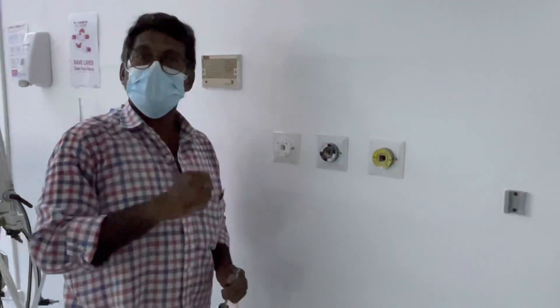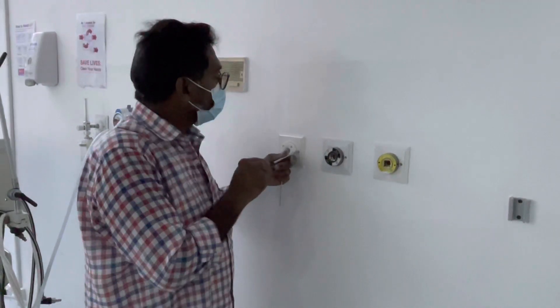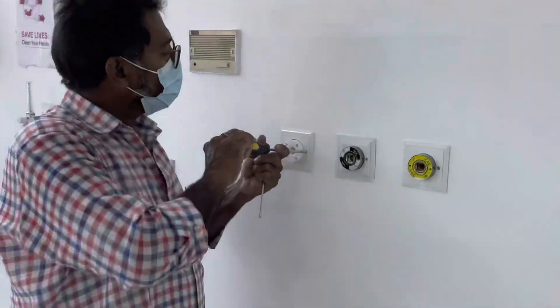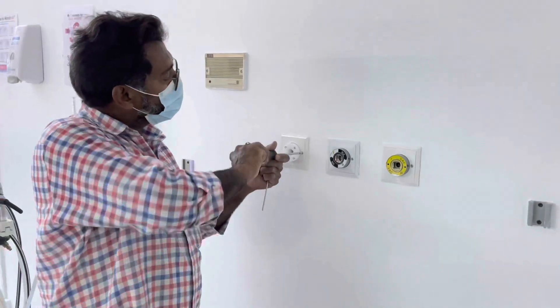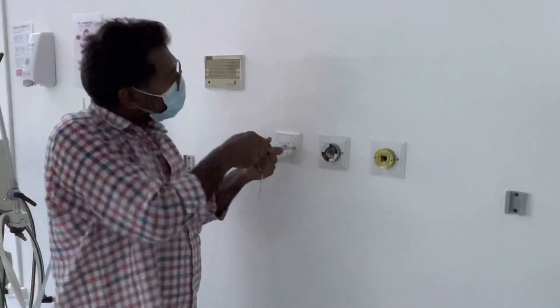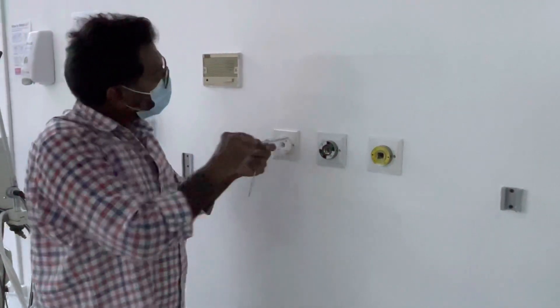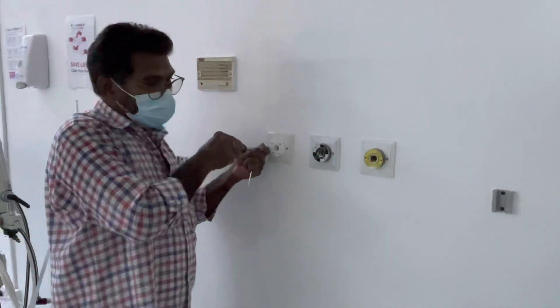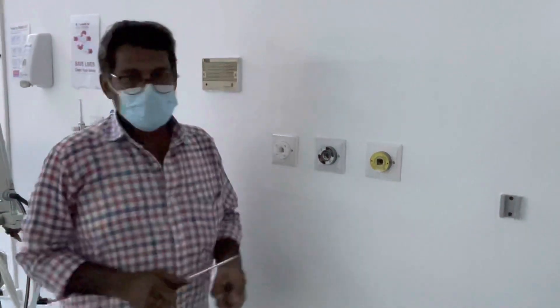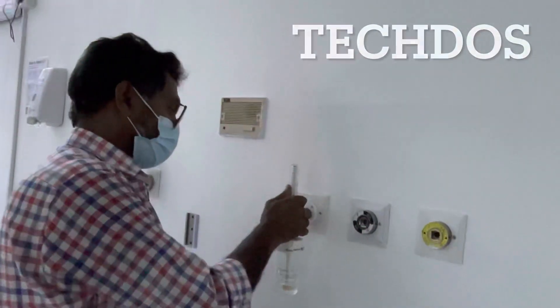The technician is explaining how to install and remove the flow meter to ensure the outlet is used without any leak. His name is Farok, and he has been working with the company for approximately 25 years. He is putting the flow meter on to check the pressure and leakage.